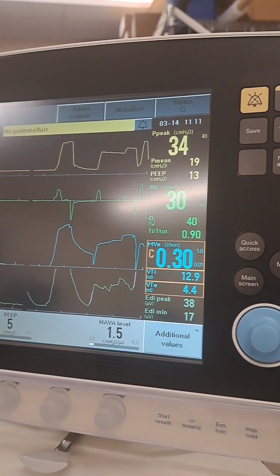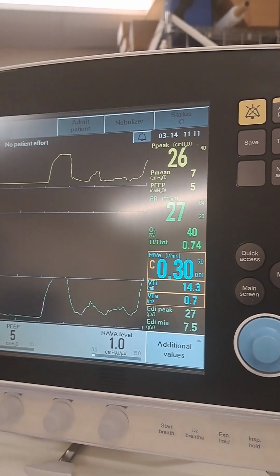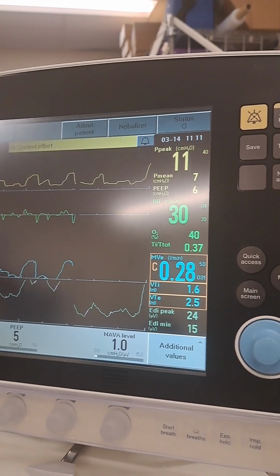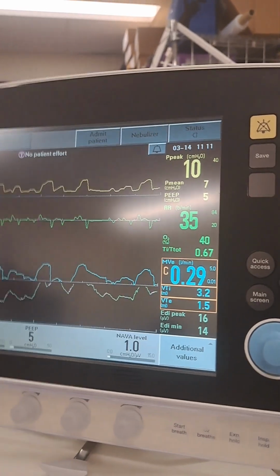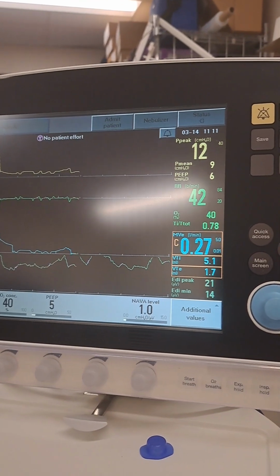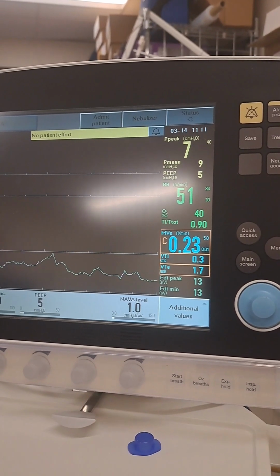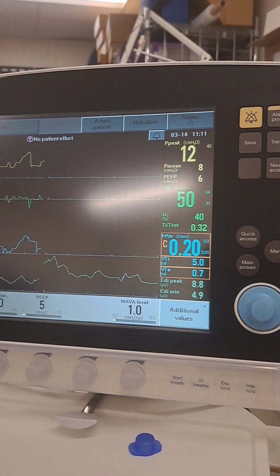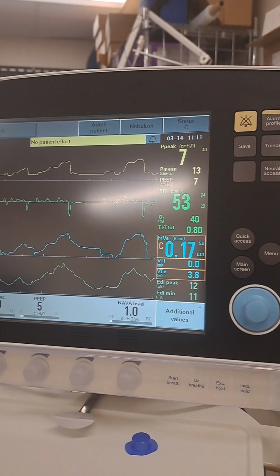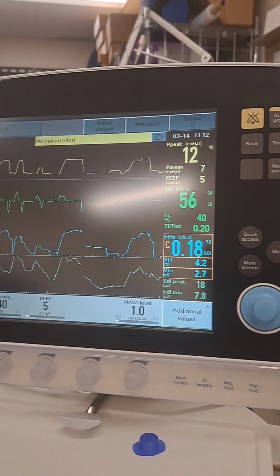Now, the opposite of that, say I have them on a NAVA level of 1, right? We let the kid chill out a little bit. My EDI peak now is 18, 20, 18, 19, 18, 20. And you're watching the kid and you're like, we need to adjust our NAVA level a little bit. We may want to increase the NAVA level until you get more of that mid-range. Or, why did they go up? Our respiratory assessment skills, may need suction, just little things, or if they have fluid retention, or just different things like that.